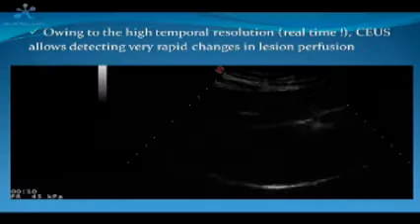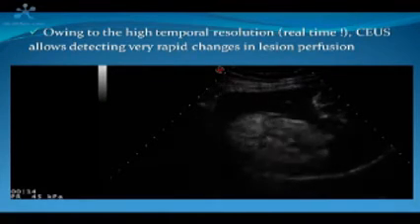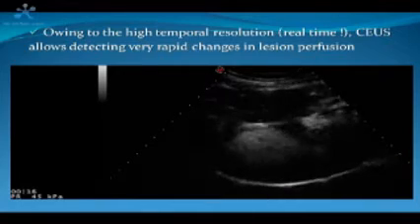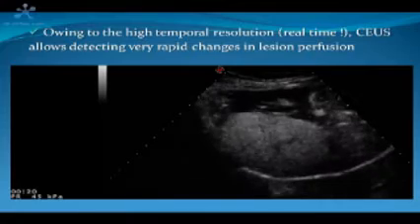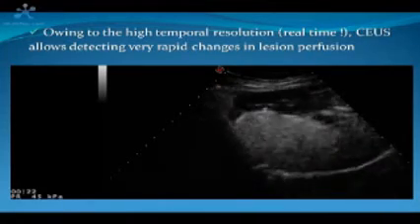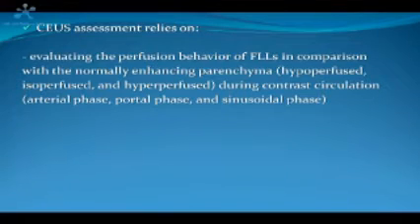And of course it's a real-time imaging modality, the only one, so there is a high temporal resolution allowing to detect very fast changes in the lesion.